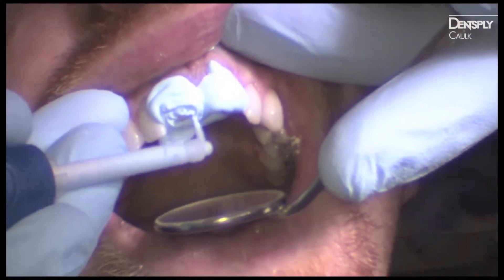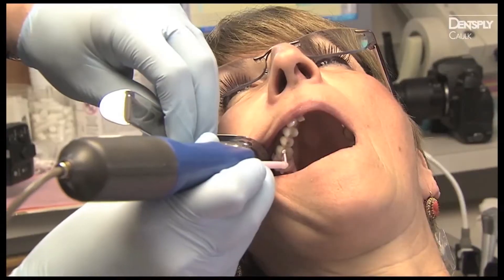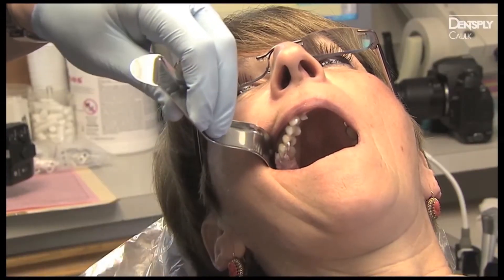For best results, flood the sulcus and go around the tooth twice. Cover the entire prep if desired. Each single-unit or multi-unit cartridge comes with precisely measured amounts of wash material.